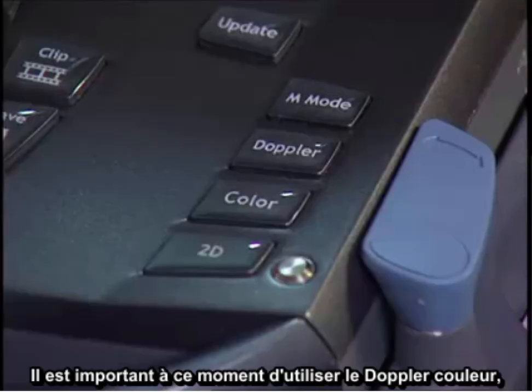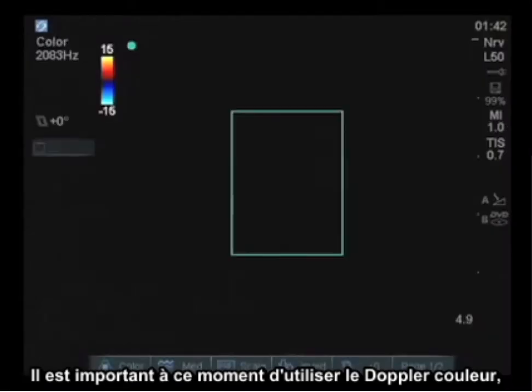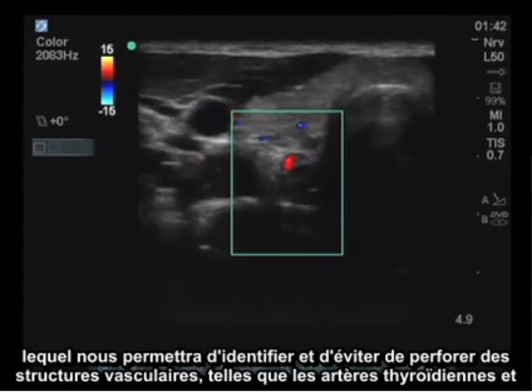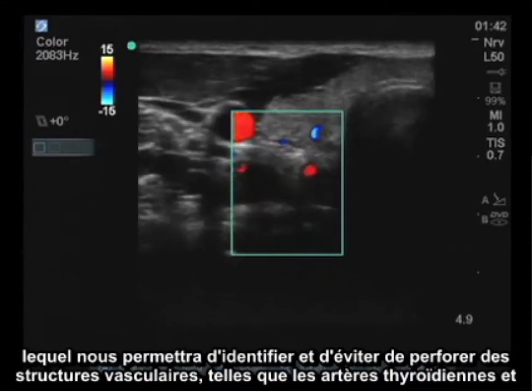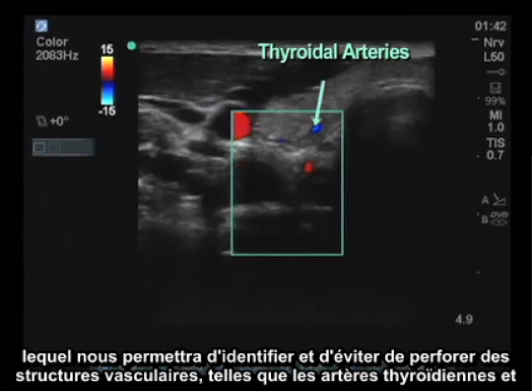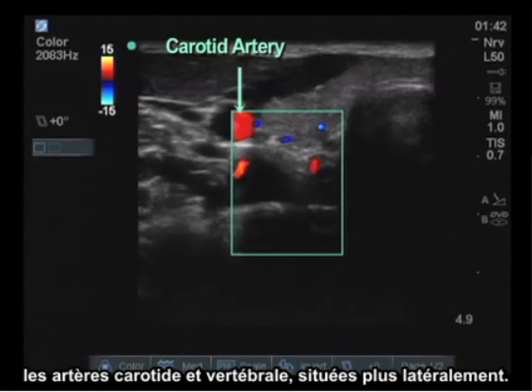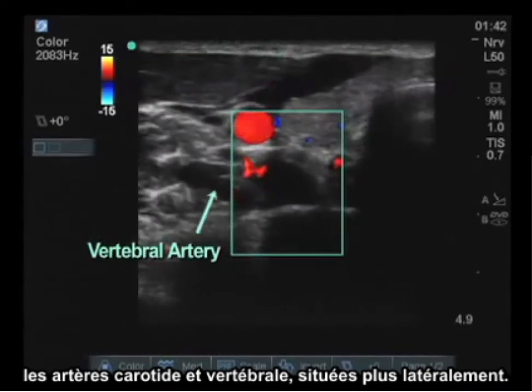It's important to note at this point to utilize the color flow Doppler, which will indicate vascular structures such as perforating thyroidal arteries that are not to be violated, as well as the carotid artery and the vertebral artery more laterally.